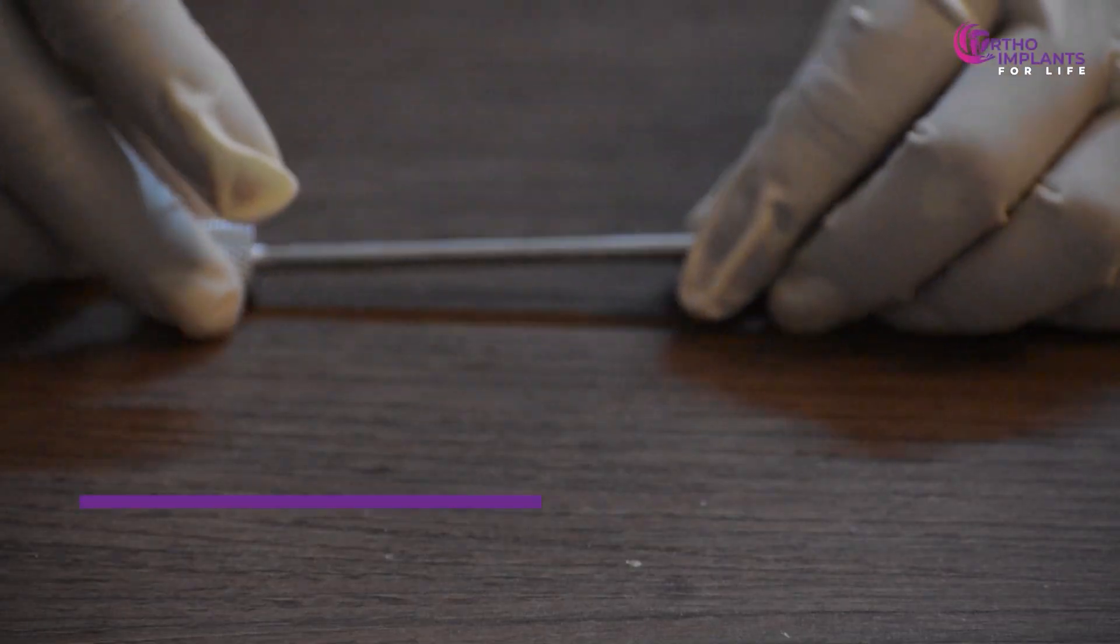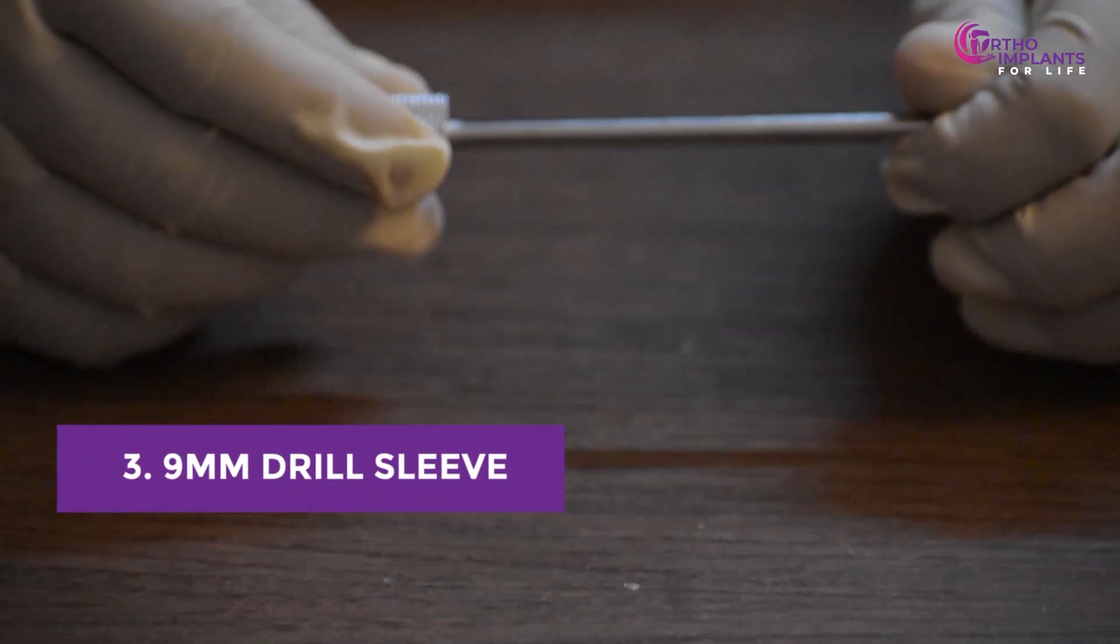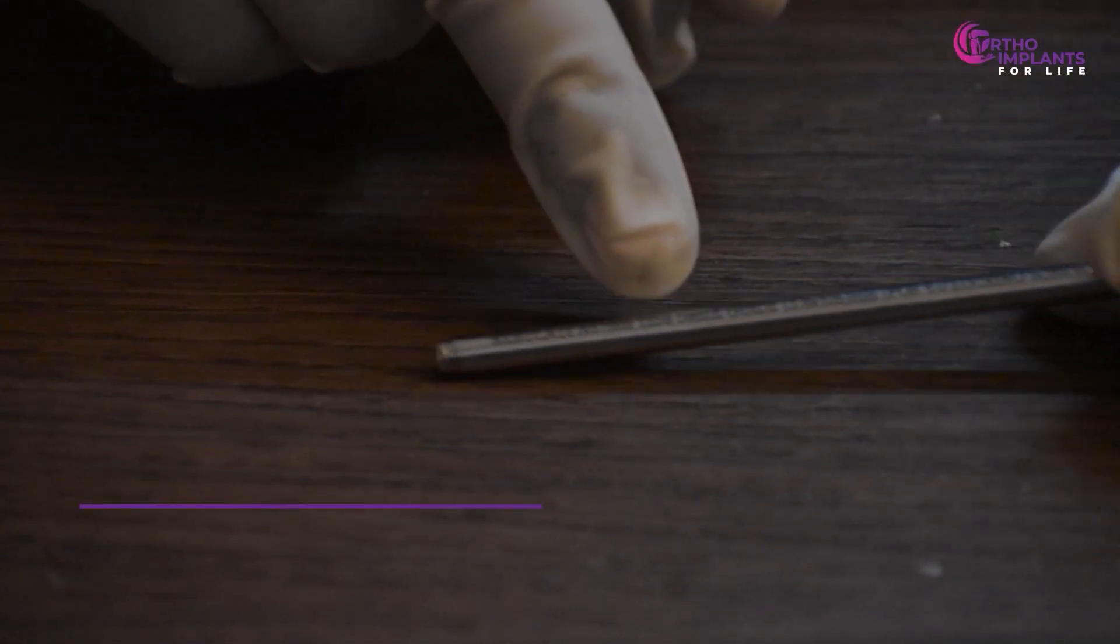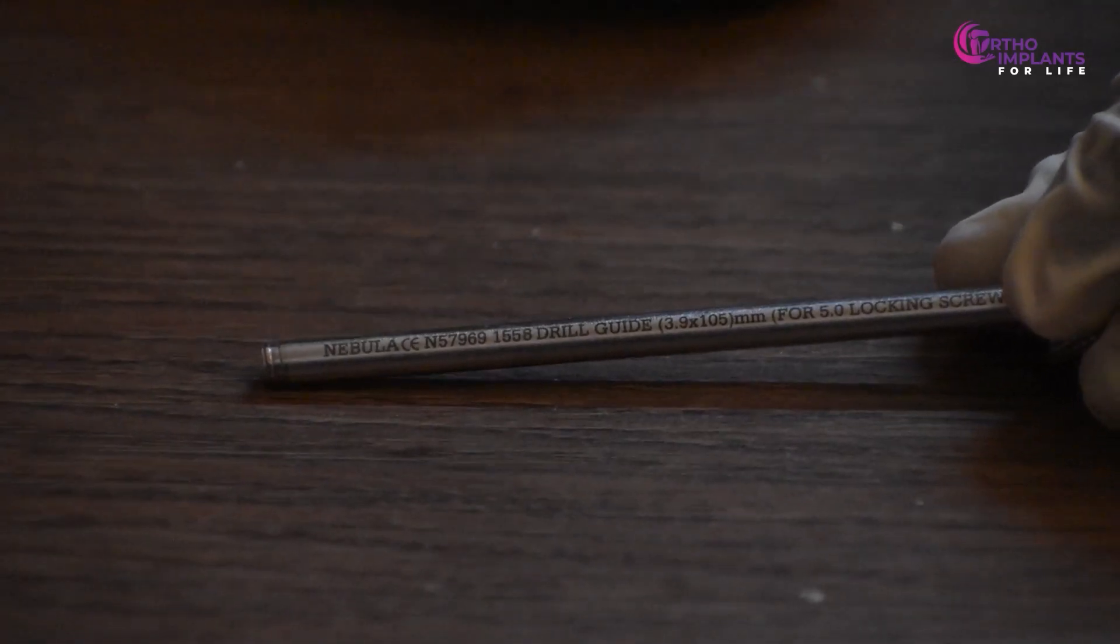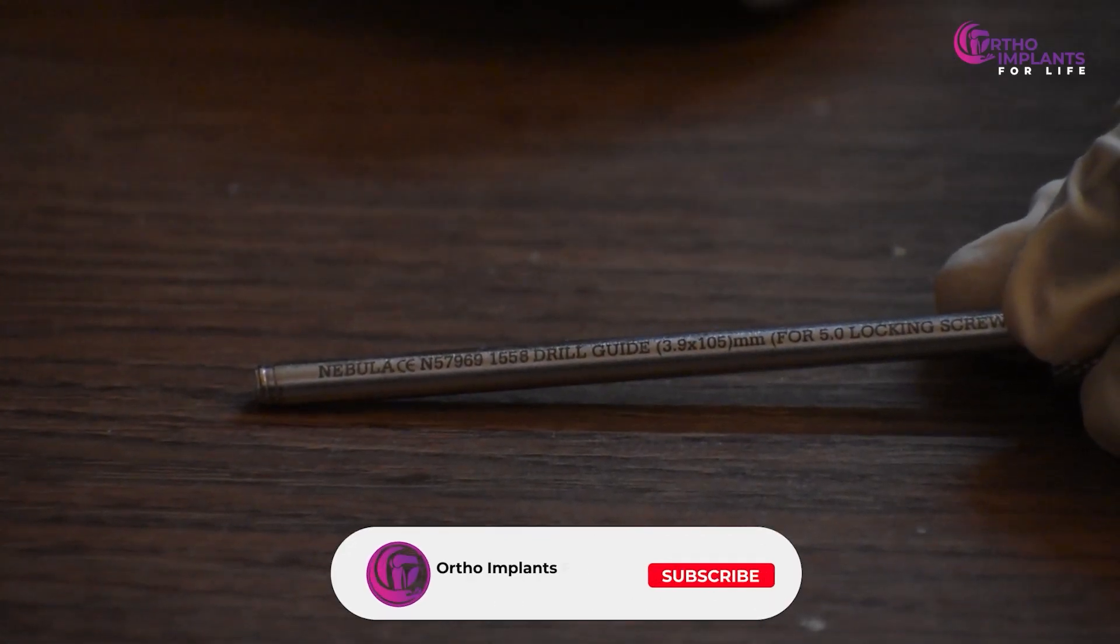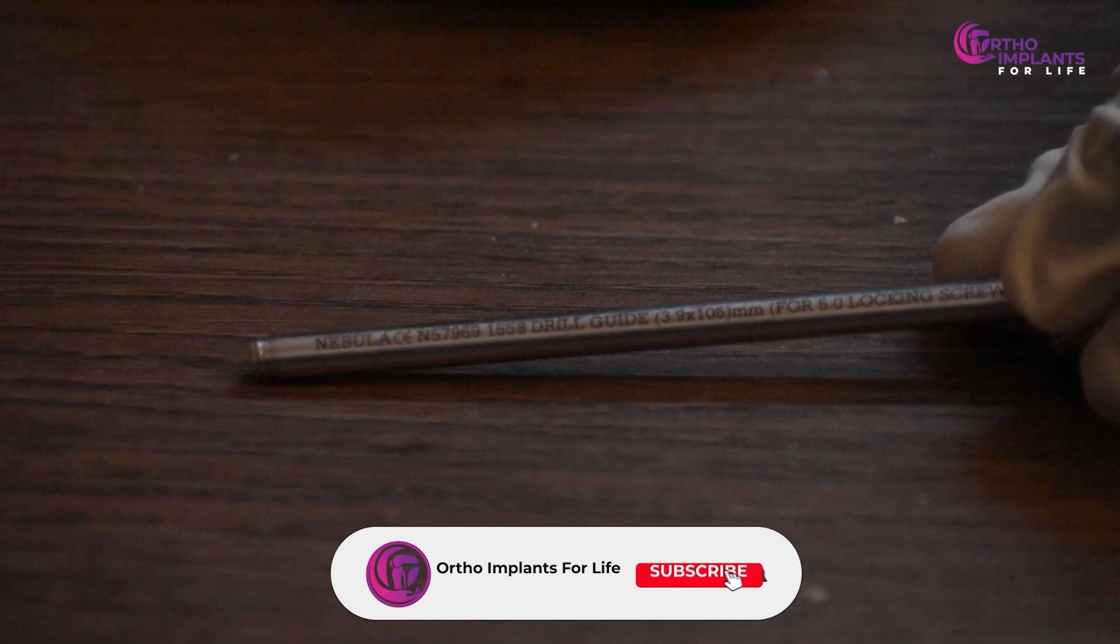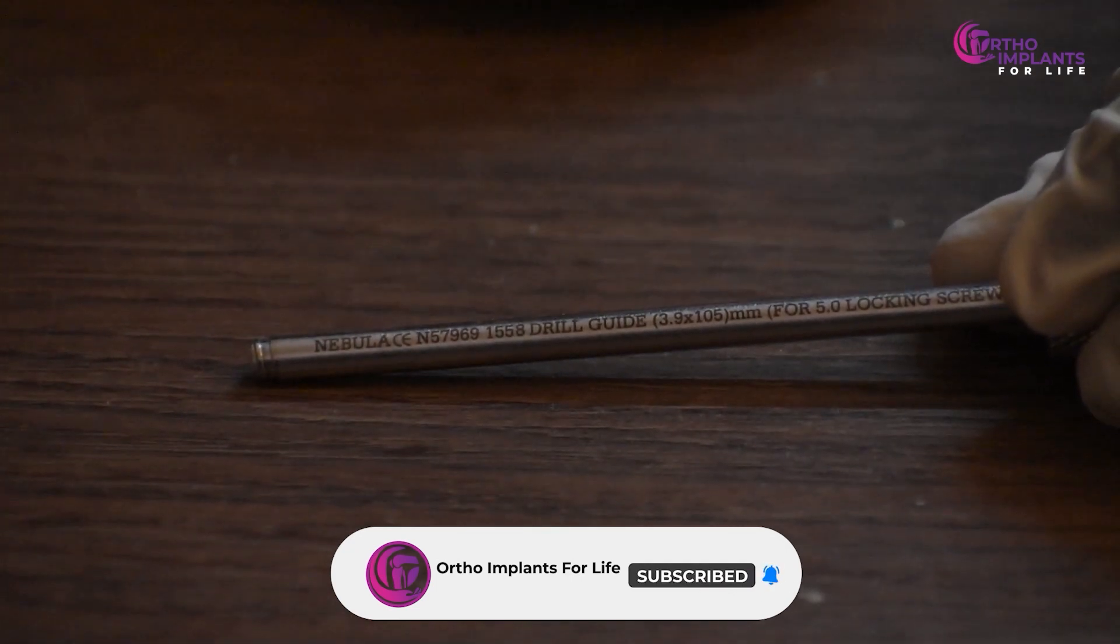Next is the 3.9 mm drill sleeve, which is used for the 5 mm locking screw. Followed by the 3.2 mm drill bit, which is designed for the 4.5 mm cortical screws.